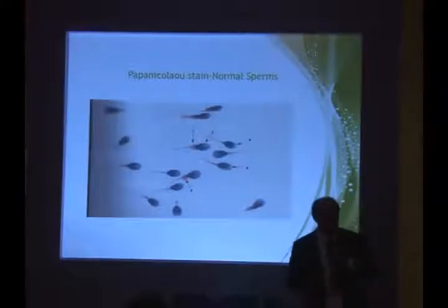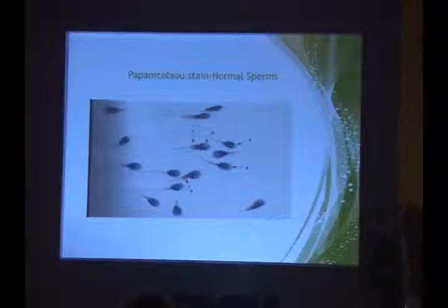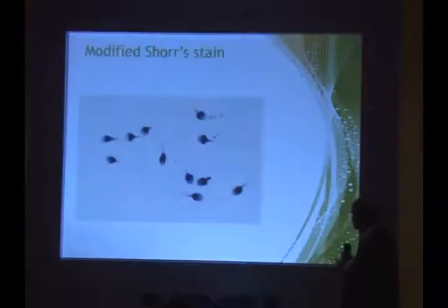So even in a population which is obtained from the internal os, here also 60-70% sperms are normal, the remaining are abnormal. If that filter was not there, you will see that the majority of sperms are showing subtle abnormalities, because now you know what constitutes normality. So any deviation from that, you are going to classify it as abnormal.